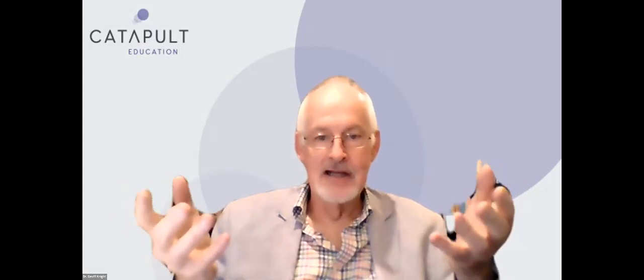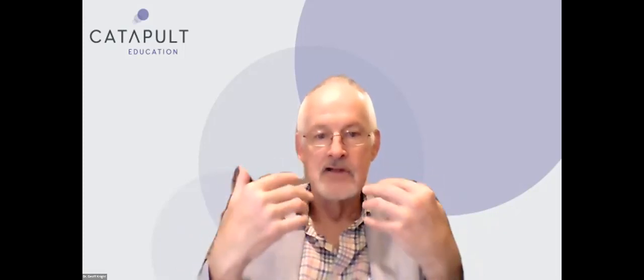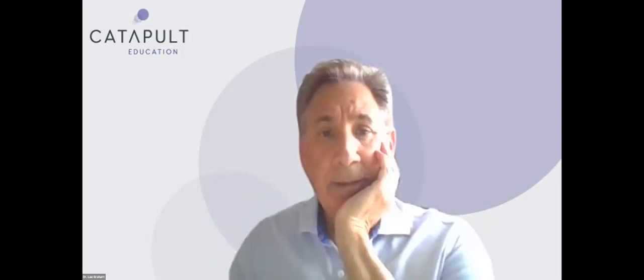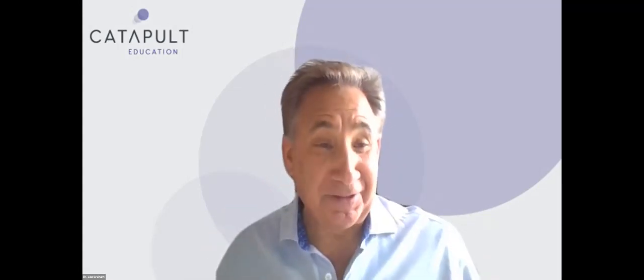All right. So, I mean, look, we use an aerator. It's pretty dangerous. You slip with an aerator, you don't, people come back. I've seen dentists send me slides showing this white eschar from silver fluoride all over the gingival tissues. It's not supposed to go on gingival tissues. It's supposed to go on the caries. I mean, for goodness sake. Is that short enough, Lou? Yeah. That was great. Jeff, listen, it's point counterpoint with Lou Graham.